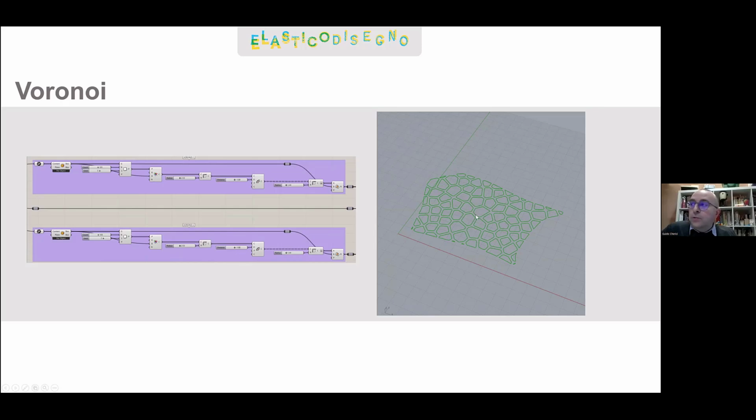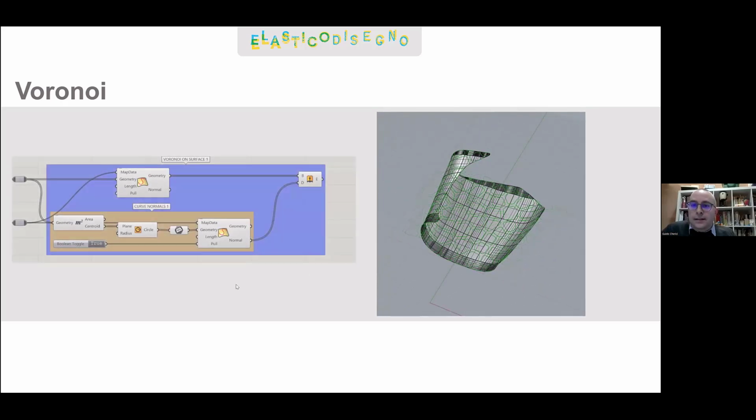See the offset of -1, which means 1 millimeter on each side, generating this 2 millimeter bridge around each cell. Then, using Shape Map again, we applied this pattern back onto the surface. Here, for clarity, I'm only showing one of the two Voronoi patterns. So we applied it back onto the surface, and then we had to start cutting, to start generating the solids to use for cutting the surface.